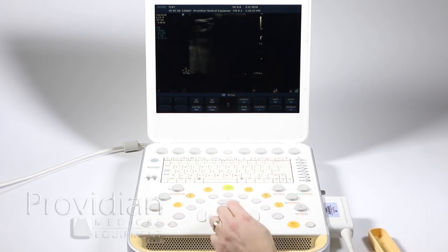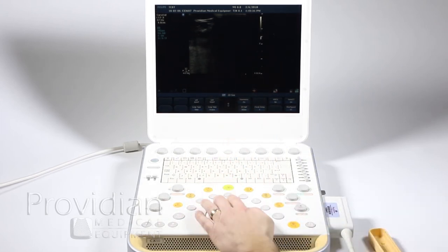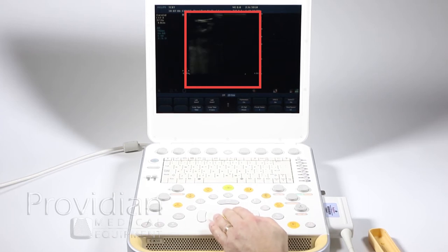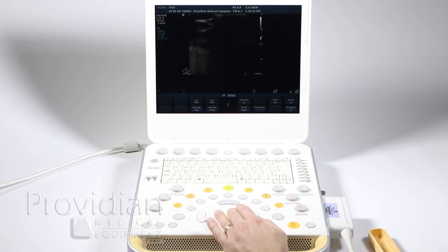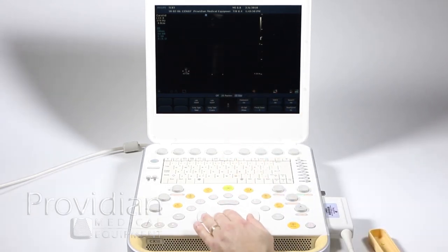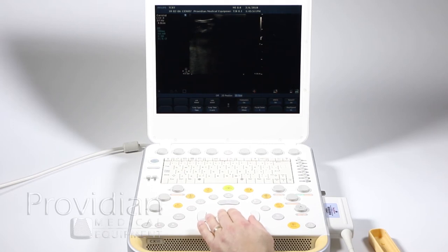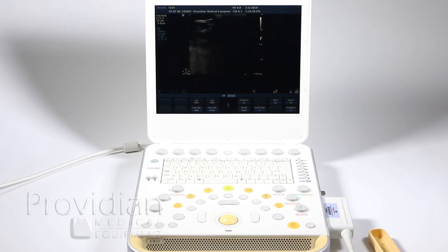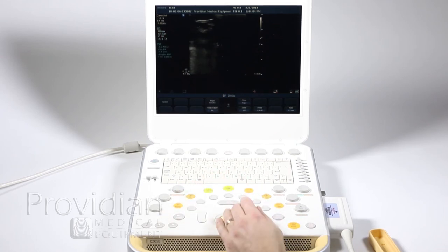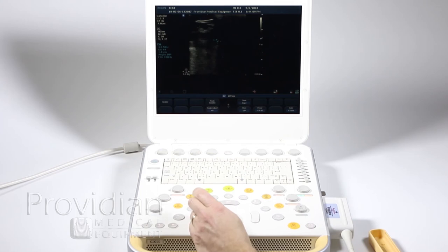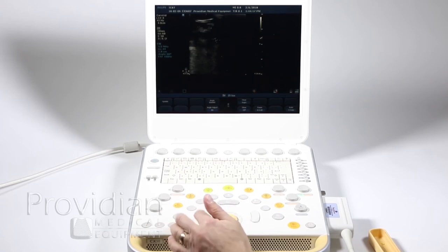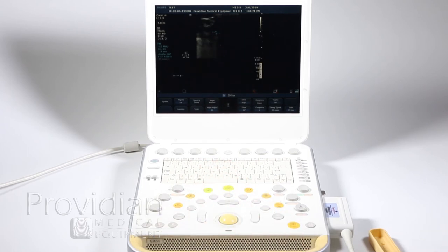Up here you'll also see it says 'off' and '2D size' — this controls what the trackball does. If you press it, it will go to 2D size and you can decrease or increase the width of your image. This works with all the probes and basically increases the frame rate when you narrow it. We went up to 174 frames per second by making it small, and back down to 37 frames per second when making it wide. So this would be the first thing you do if you need higher frame rates on your image.